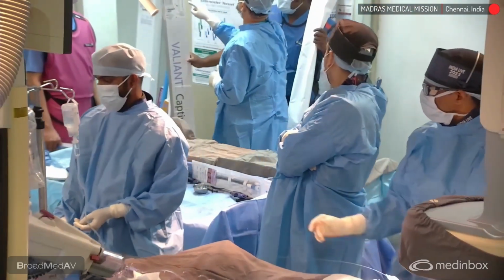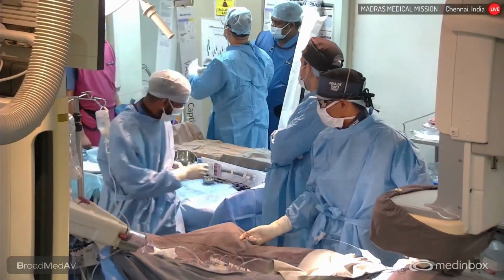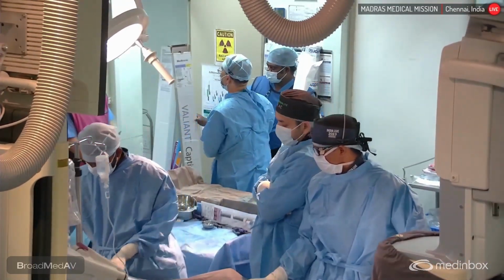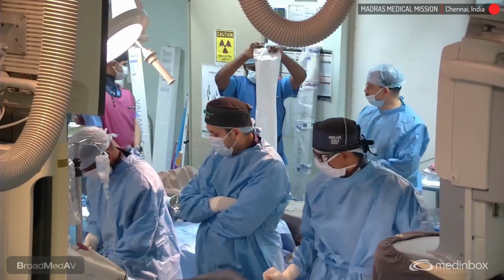So this is the Valiant Captivia device we are taking. It is 36 millimeter at the origin and 32 millimeter. So it's a tapered stent so that it adjusts to the size of the aorta which is coming down in this case.